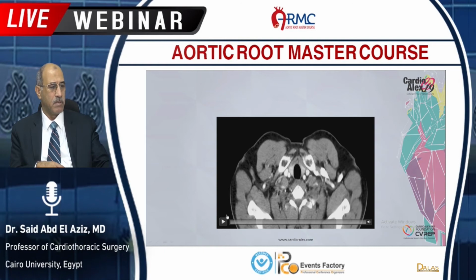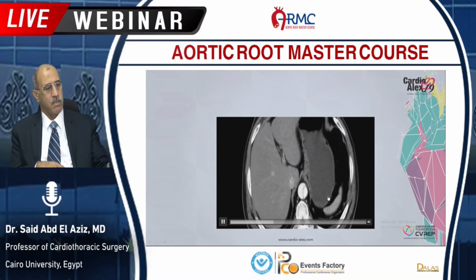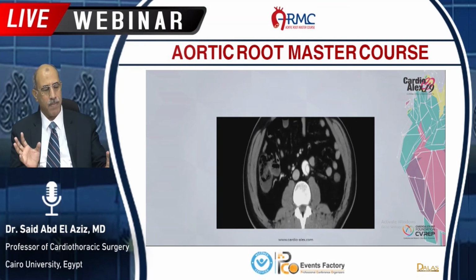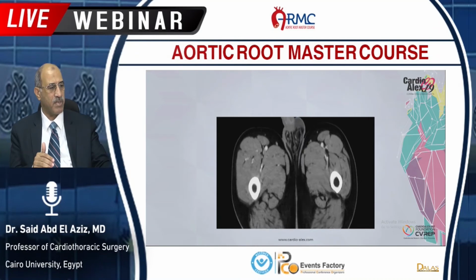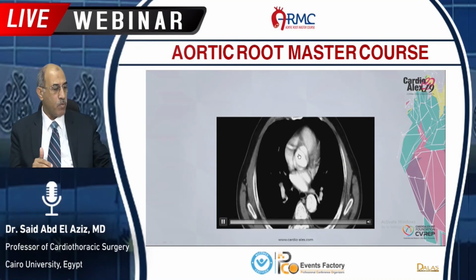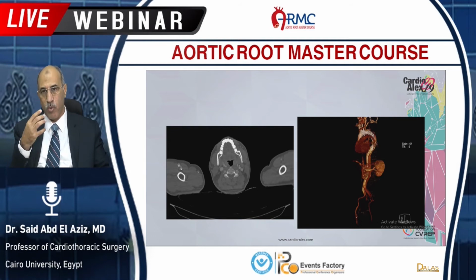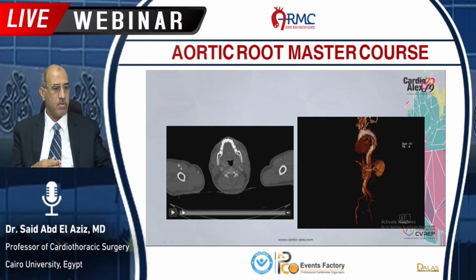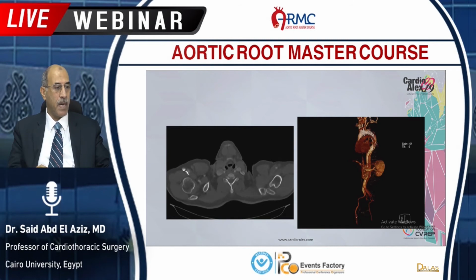This is another case. This is a CT scan of a case with type B dissection. Just a simple type B dissection, but it starts immediately at the subclavian artery. You can see it here. So we have no landing zone. So that's why, this is after deployment of the stent, but we did for that patient a carotid subclavian bypass to create a proximal landing zone. In that video, I will show you the bypass.